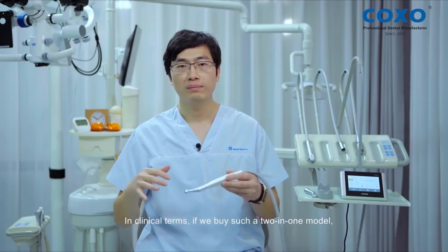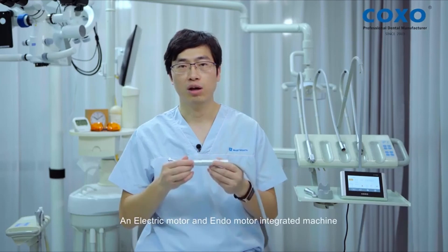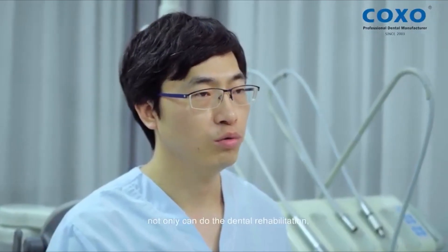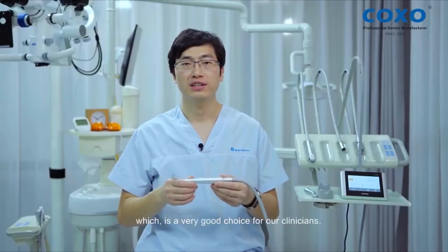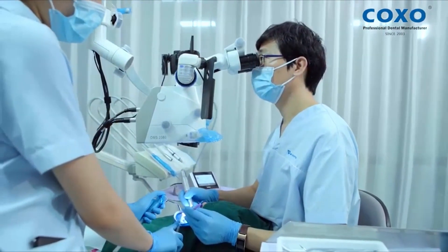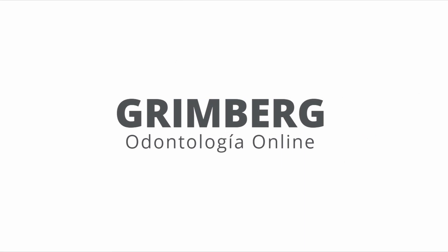In clinical terms, if we buy such a two-in-one model, you can also save a lot of cost and avoid some trouble. An electromotor and endomotor integrated machine not only can do dental rehabilitation, but also can treat root canal, which is a very good choice for our clinicians and patients. For more information, visit www.yuan-seal.com.